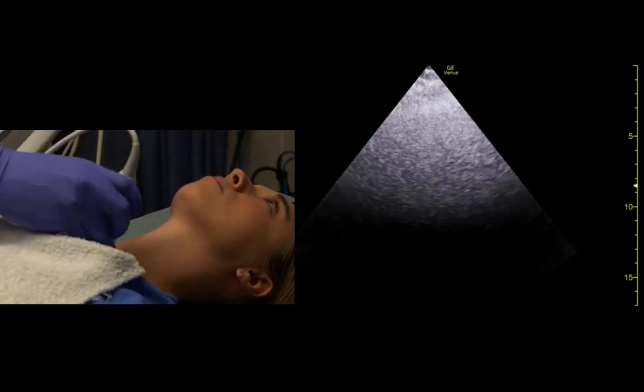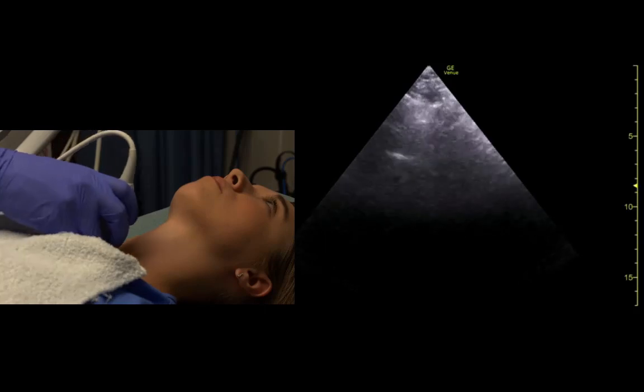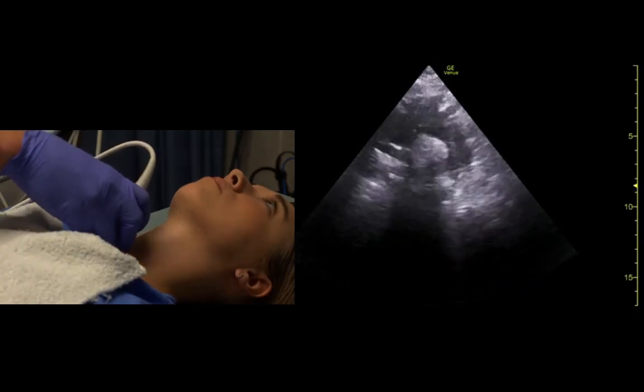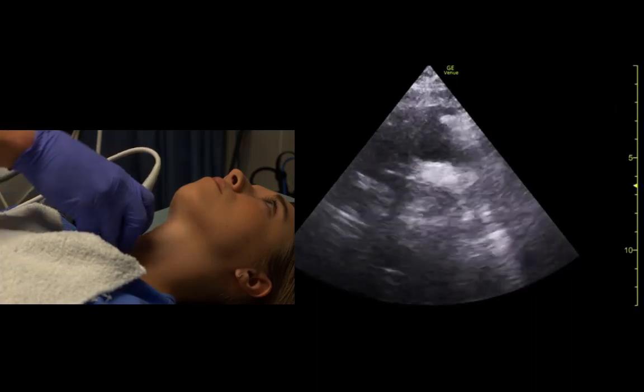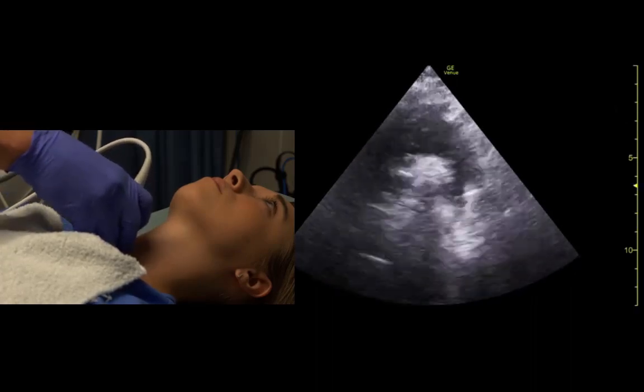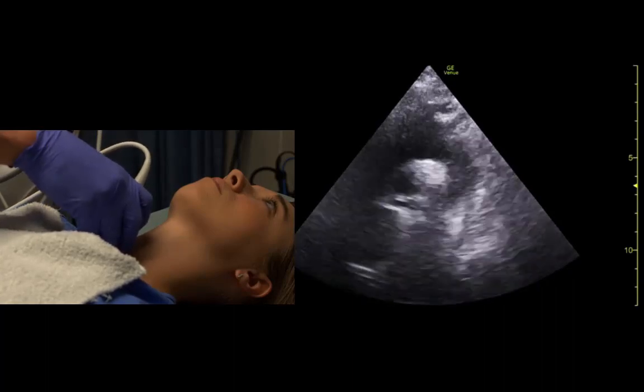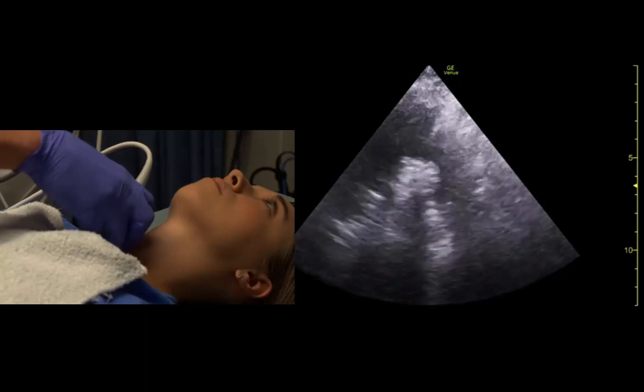Indicators between two and three, and we fan towards the feet. We should be able to see the aortic arch. The right pulmonary artery sticks out right at us there.